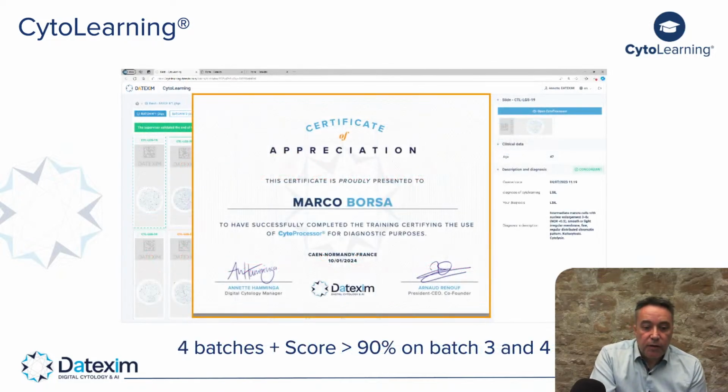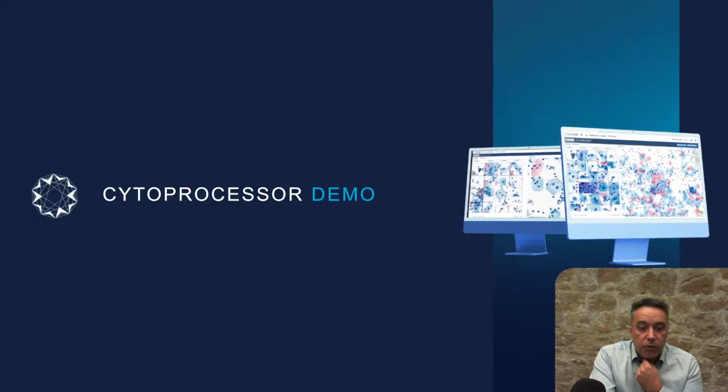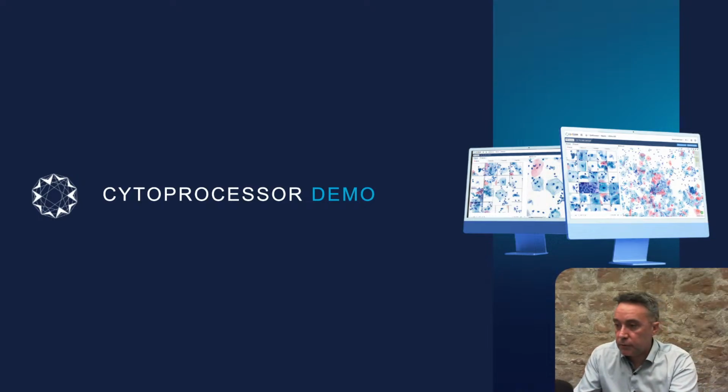To be certified, you have 4 batches to do, and you have to have a score greater than 90% of concordance on batches 3 and 4 to be successful and get the certification. So this is my last slide of the presentation. I will now hand over to Annette, who will do a demo for you of this new version of CytoProcessor.